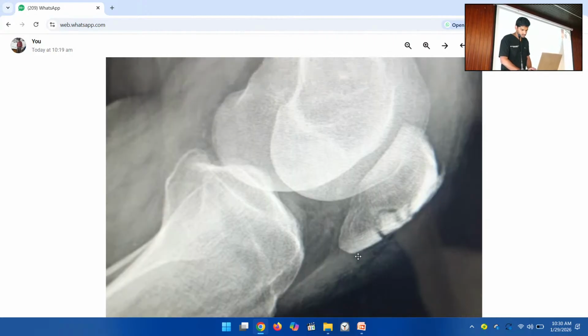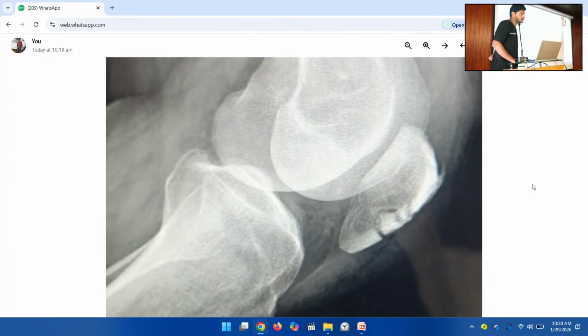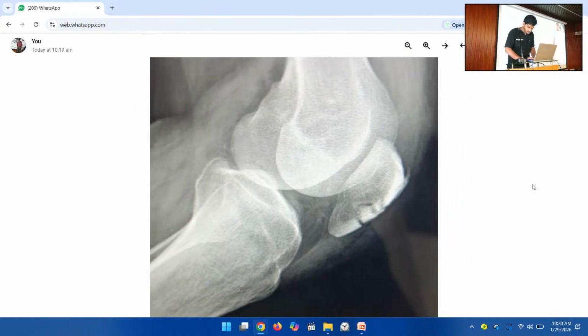Direct injury. Fall on the steps. No operations. I should not say on this one. AP, skyline view.